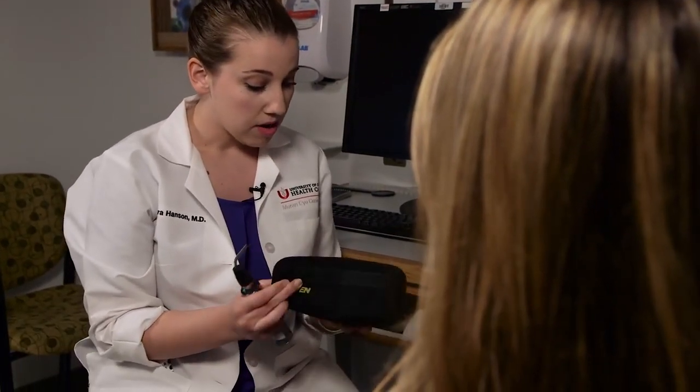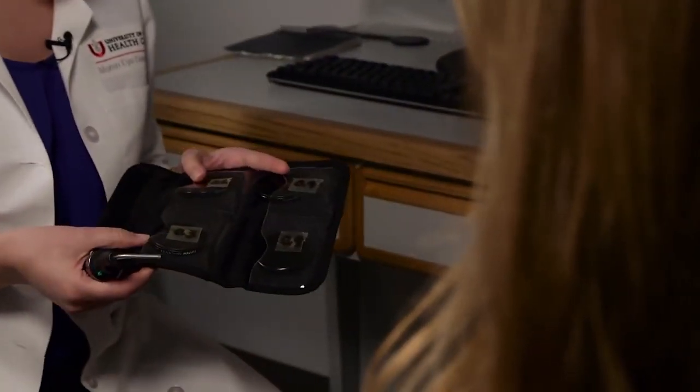Okay, so now we're going to be testing for an afferent pupillary defect, and we'll talk about how to measure the size of the defect. All you need is a muscle light and some neutral density filters. The ones that we have here are in 0.3 log unit increments, and we have a 0.3, 0.6, and 0.9. So you're going to start out by asking the patient to focus on something in the distance. You're going to use the muscle light to shine into each eye. And then you do the swinging light test where you go back and forth between the 2 pupils.